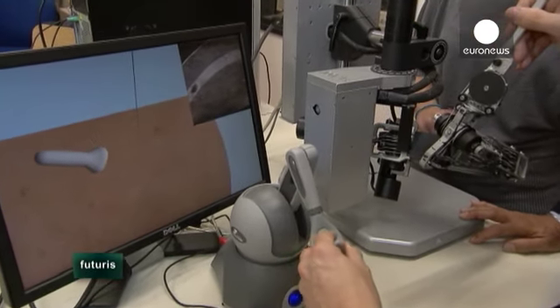Simulation helped us to define the requirements of a given surgery, but also to define some particular anatomical features of a kidney tumour. How big is the average tumour? Or what are the normal distances between human organs? We also try to understand the biggest complications a surgeon can face during this kind of surgery and how he might respond to these complications.